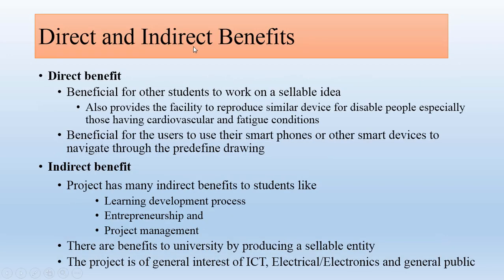Direct and indirect benefits. Direct benefits. We have listed two benefits over here. This project is beneficial for other students to work on a sellable idea. It also provides the facility to reproduce similar device for disabled people, especially those having cardiovascular and fatigue conditions. The second direct benefit is that this project is beneficial for the users to use their smartphones or other smart devices to navigate through the predefined drawing.